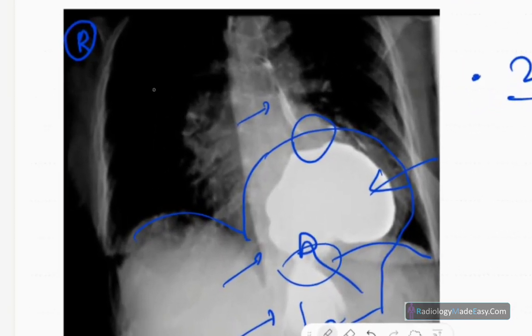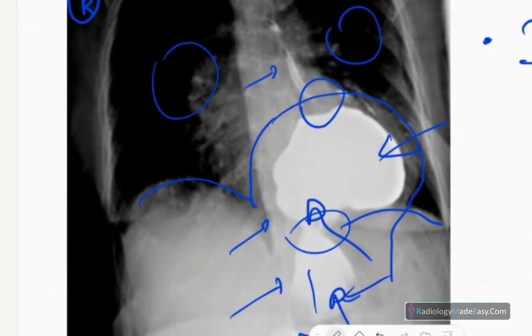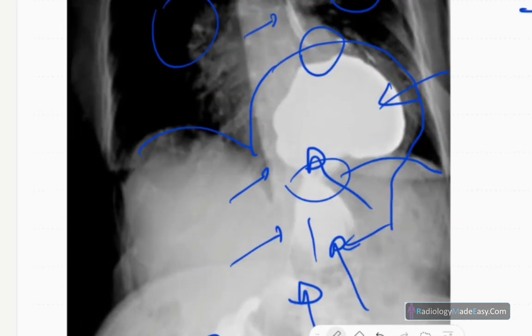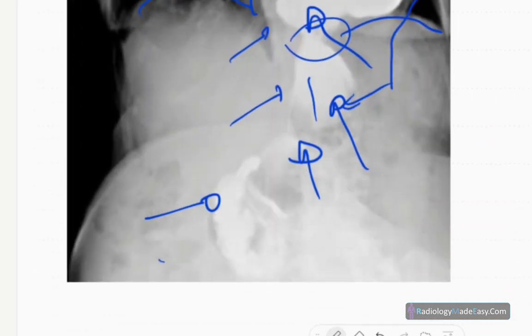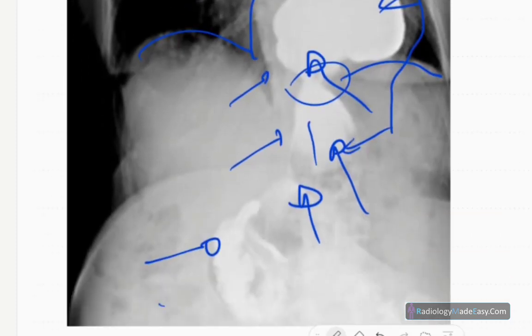There are no opacifications of lung fields and no contrast leakage into the mediastinum to suggest fistula tracts or perforations. Visualized bones are normal. You don't see any narrowing or abnormal dilatation in the esophagus, and no filling defects in the stomach to suggest neoplasms.